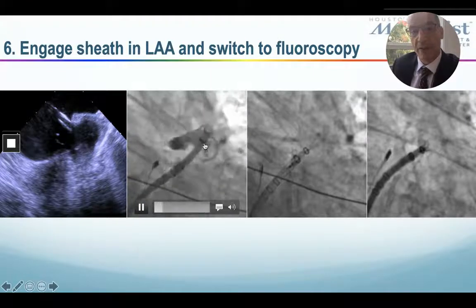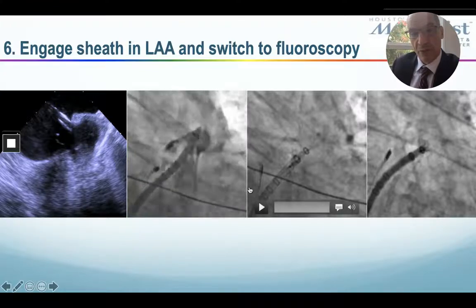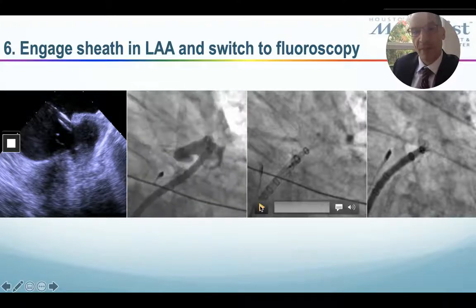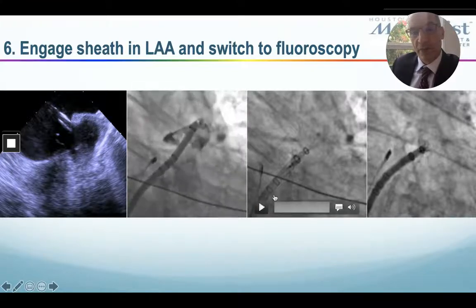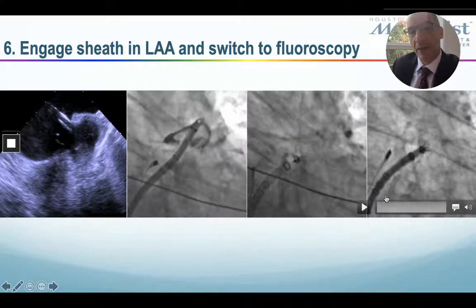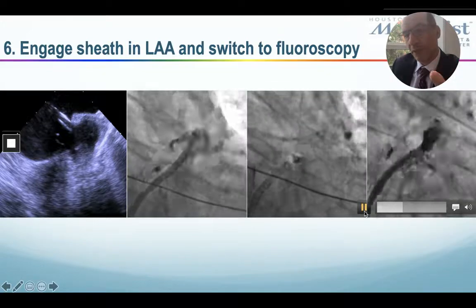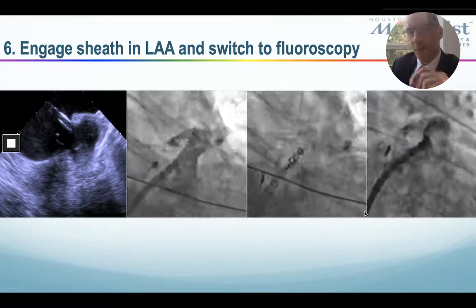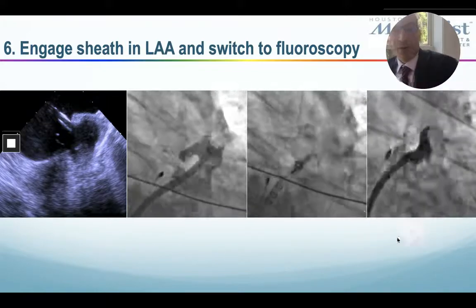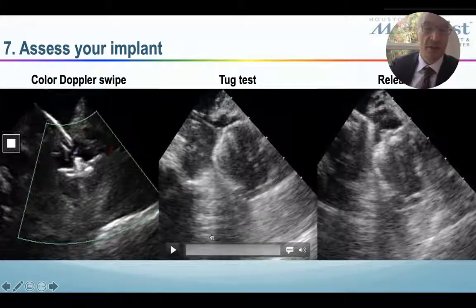You can see this appendage, kind of a chicken wing with a posterior lobe going backwards, perhaps below the pulmonary artery. So we don't have a lot of usable depth. Nevertheless, we deploy the Watchman. It takes its shape, and then we obtain our standard angiographic views to confirm that it's placed in the right location. But we also need to see how the appendage looks on echo.